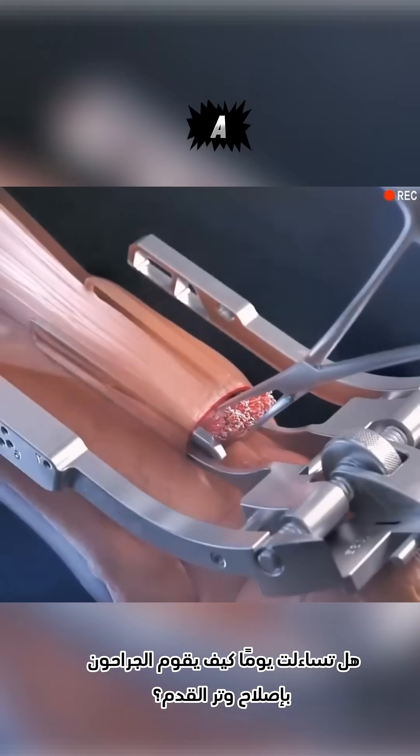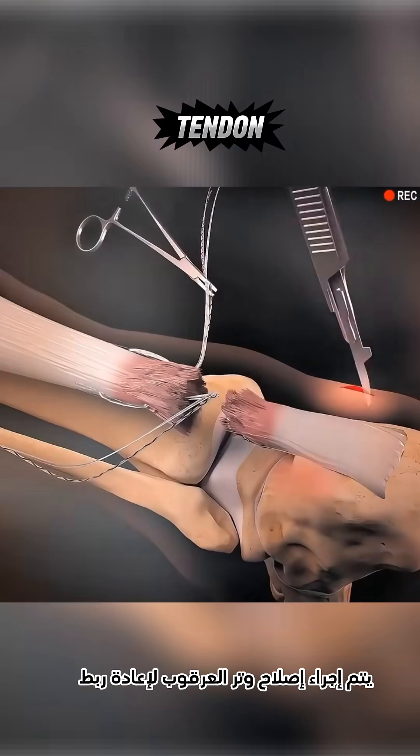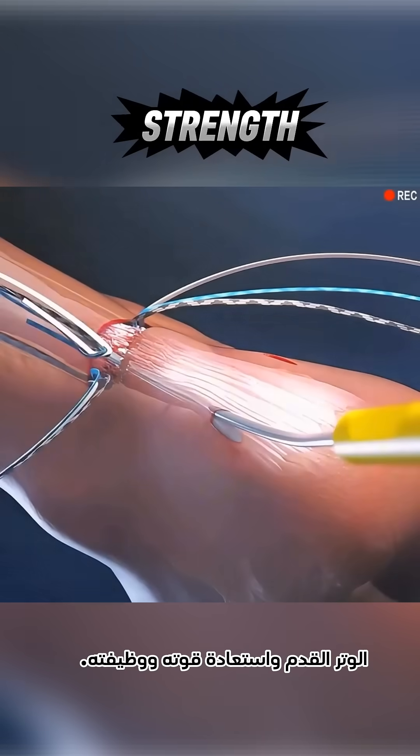Ever wondered how surgeons repair a torn Achilles tendon? Let's take a closer look. Achilles tendon repair is performed to reconnect the torn tendon and restore its strength and function.